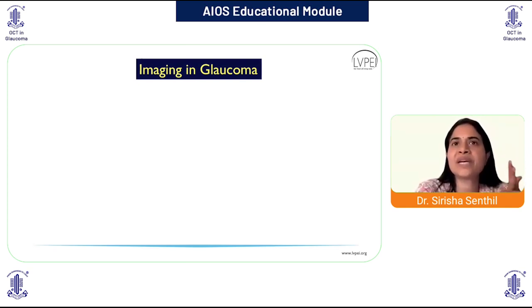And in that patient who had a chronic CSER with RPE degeneration and RPE atrophy, the autofluorescence actually showed a huge defect that correlated with the clinical picture, the imaging, as well as the visual fields. So remember clinical correlation, and make sure that whatever you're seeing, you're able to explain. And if you are not able to explain, either going back and re-looking at the patient or going back and repeating the imaging device or the visual field is very, very important.